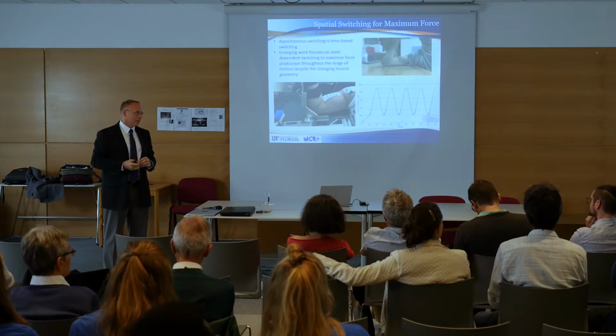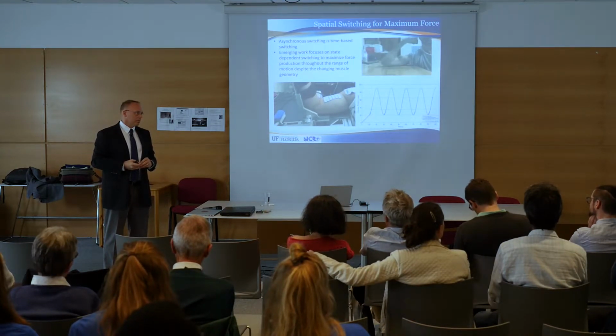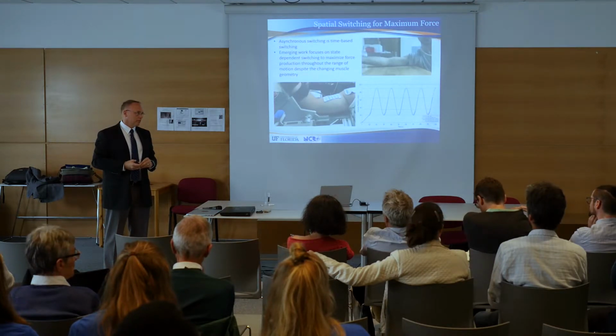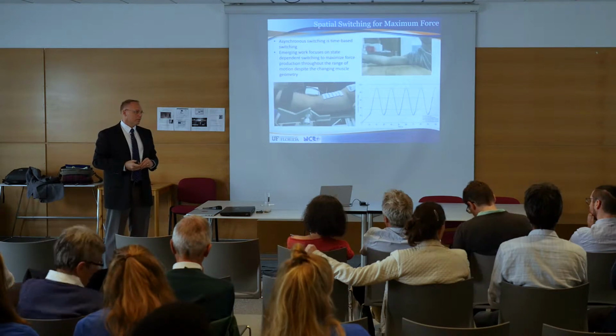By having these smaller channels and distributing the stimulation across the muscle, there are different ways you might come up with that would be more advantageous than others on where you would put the channels. Yeah, but you had no particular reason why you were placing them like this, because if it's the same area, you can also divide it differently, and then you have 4 electrodes in different positions. You were just saying, okay, we are doing it like this. Yeah, it was just one way to do it.